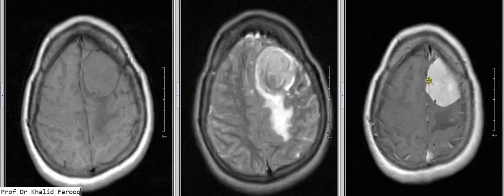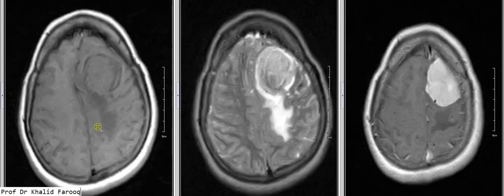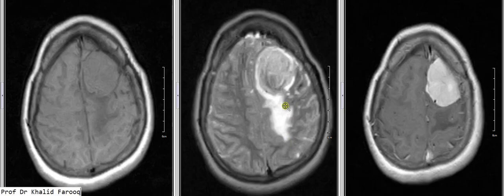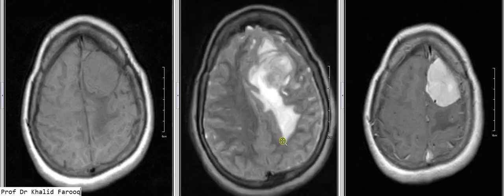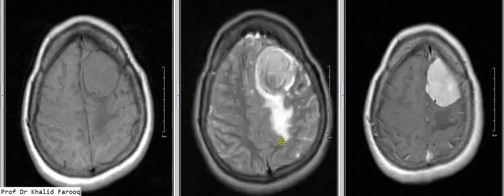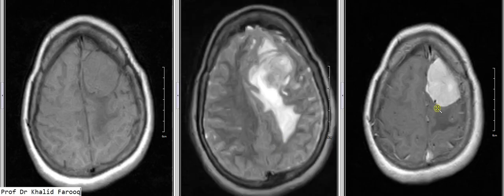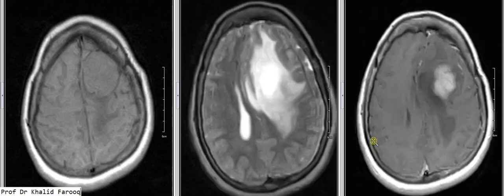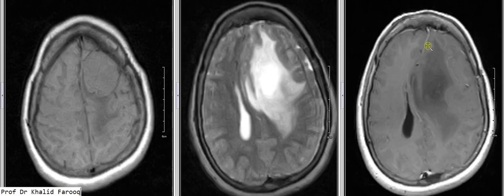Here we can see cortical vessels which are compressed by the mass lesion. We can also see low signal intensity areas in the brain parenchyma which show increased signals on T2-weighted sequence, favoring vasogenic edema. This is because of obstruction of the draining cortical vein by the mass lesion.